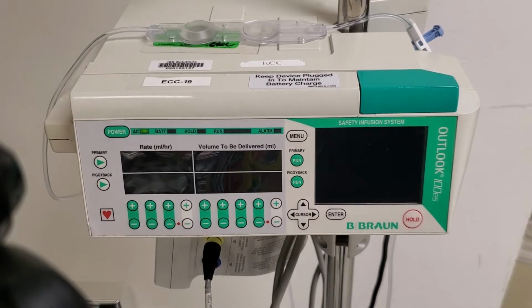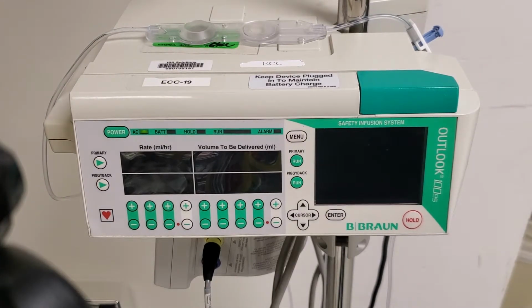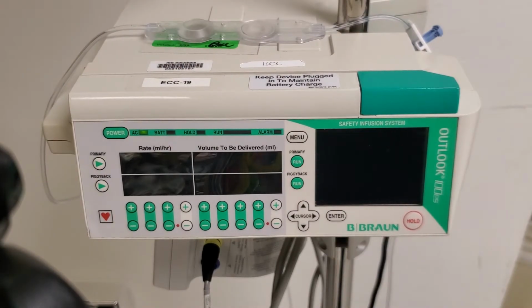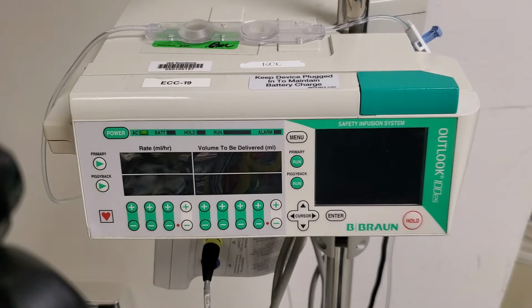We're going to very quickly go over the Braun Outlook IV pump that we use from Nathan Latour Hospital. First thing we're going to do with the pump is turn it on by pressing the power button. You'll hear a series of beeps followed by a startup sequence, and then there'll be prompts on the main screen.